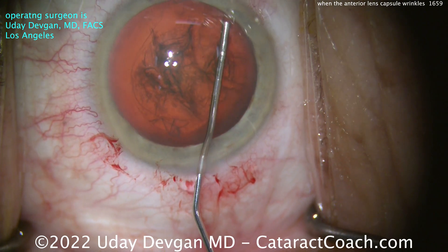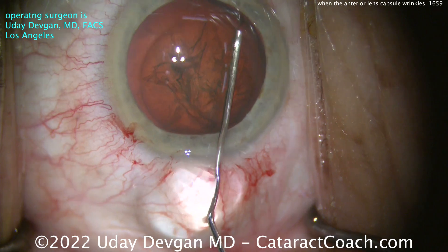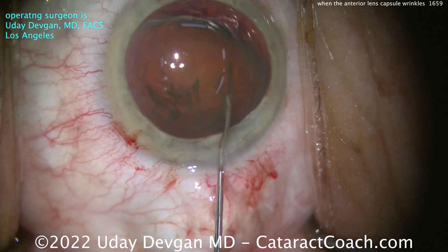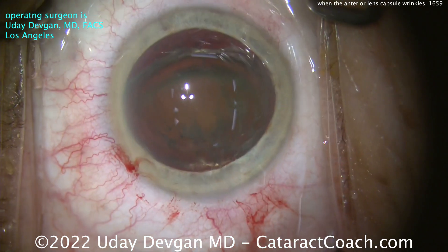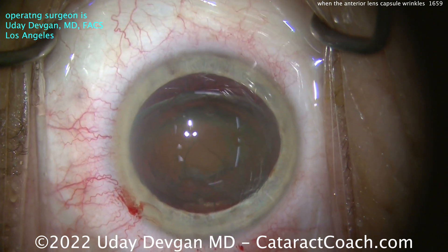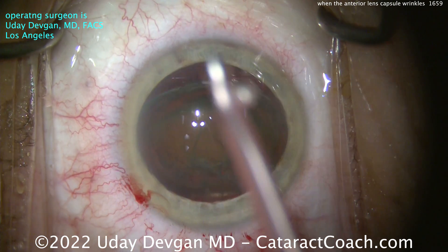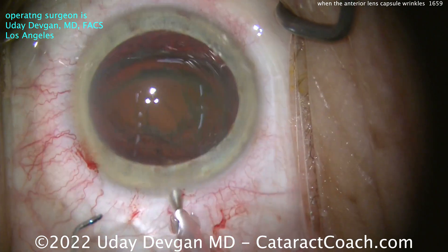I'll watch carefully during hydrodissection. Fluid wave goes across — again, everything looks pretty normal. In a case like this with suspected zonular laxity, I really enjoy getting these lenses out of the capsule bag, because when I bring it up, I know there'll be less stress on the zonular support. A little bit of hydrodelineation — you can see there's an endonucleus that's been delineated.